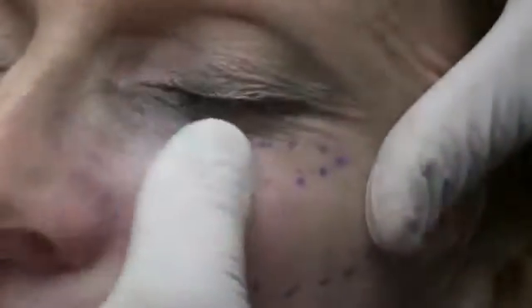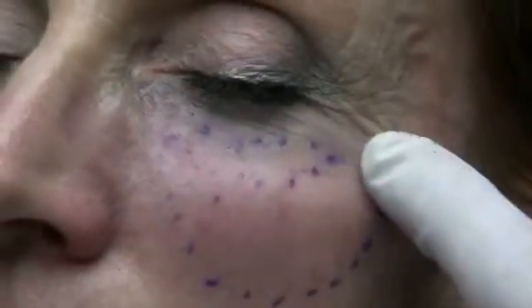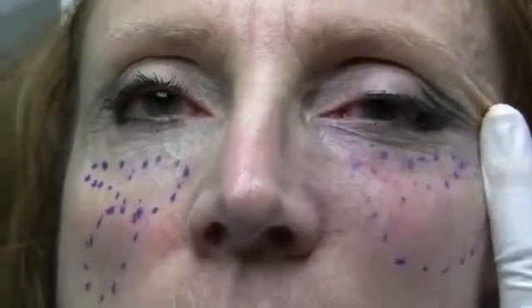So massaging this now, we have put 1 cc in this infraorbital depression in her tear trough. We may come back and put a little bit more, but if you look at this side versus this side, I believe you can see the difference. She has some nice malar or submalar anterior maxillary infraorbital projection now.